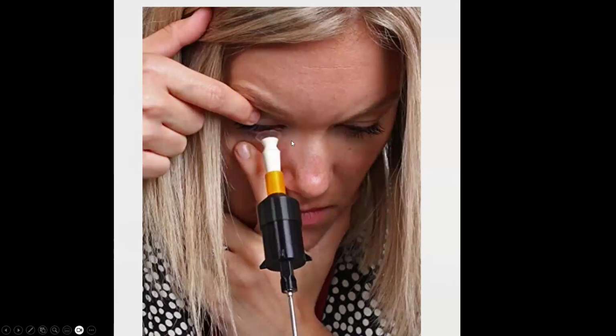Look at what it looks like here. You see the face is positioned in such a way that it's almost lying down, so you can easily put the lens on. When you use a lens holder, you can now free two hands.